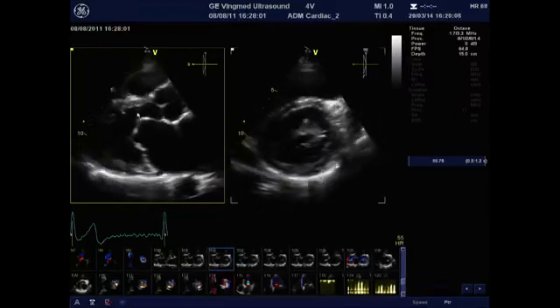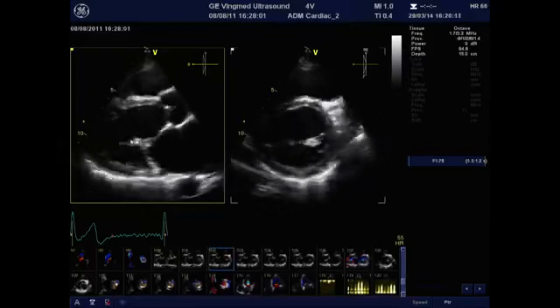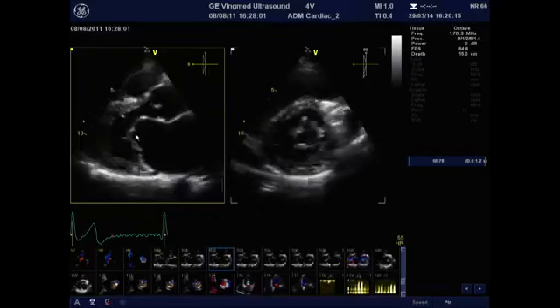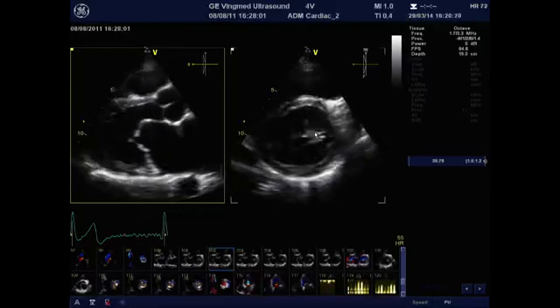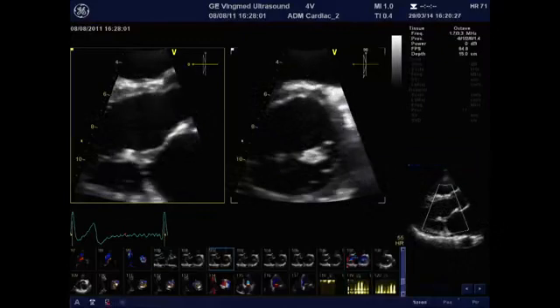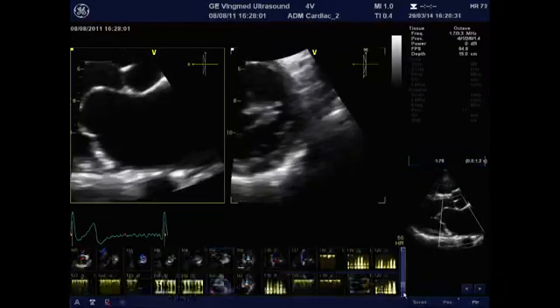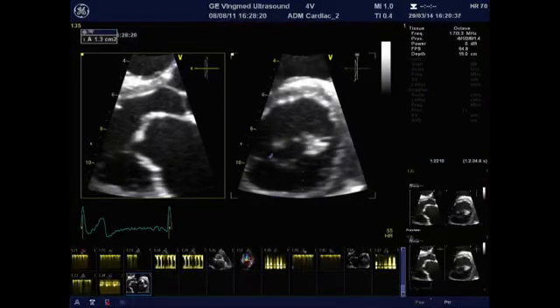I have an image like this, and I can freely move the sagittal plane from the left ventricular apex to the base of the mitral leaflet at the level of the smallest visible orifice, to have in this image the smallest orifice available. You can just zoom the image, and then you can just freeze and do your tracing. And as I did in this patient, who has a mitral valve area of 1.3 centimeters square, which is totally concordant with what we were measuring earlier.